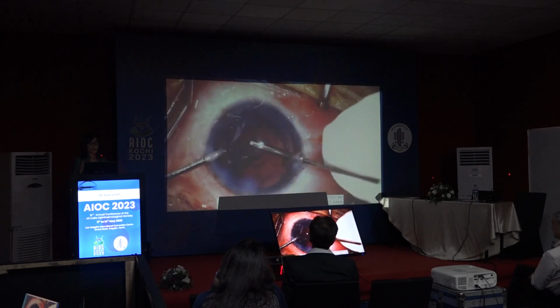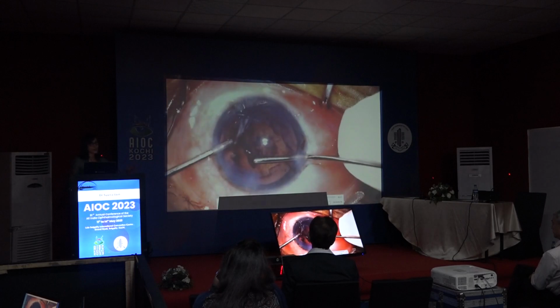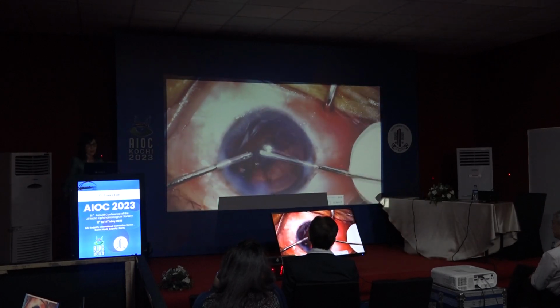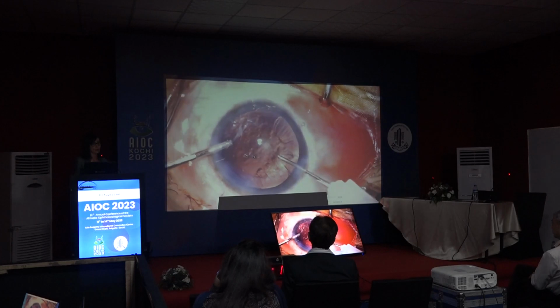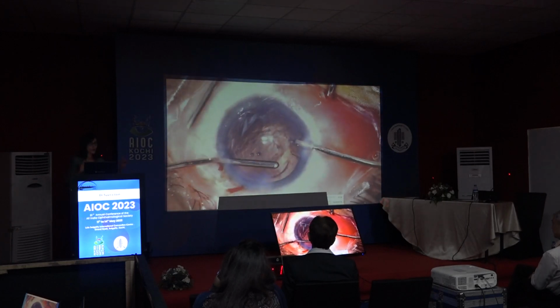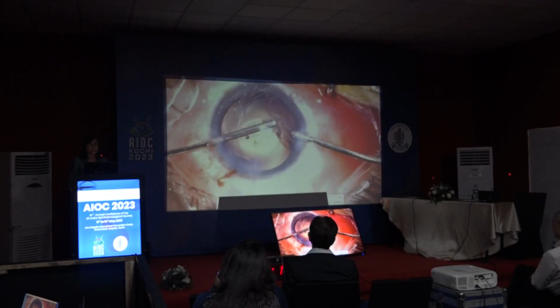I like to make sure that before I do a bimanual I/A, I have a perfect focus on the entire capsular bag, so I don't need to struggle to see. Again, I like bimanual I/A because that allows for a circumferential removal of the cortex. And even when you're changing hands for the bimanual I/A, always do a viscofluid exchange, because you don't want the posterior capsule to come anteriorly at any point.